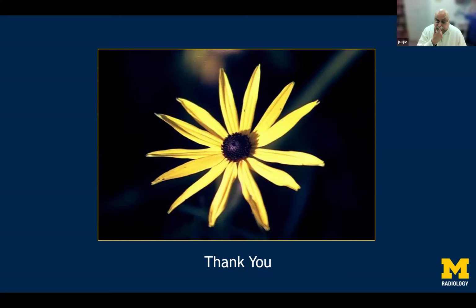There is published data, although the thing about functional imaging is that there is no consensus, and that consensus has to be built up on a national level as to what the FA values are which show that this is really abnormal, what the range of FA values is for benign and malignant conditions, and then stratify the malignant conditions based on the FA values as well. Then there are the ADC values. That's another important thing we need to go back and see, especially on diffusion weighted and perfusion weighted imaging.